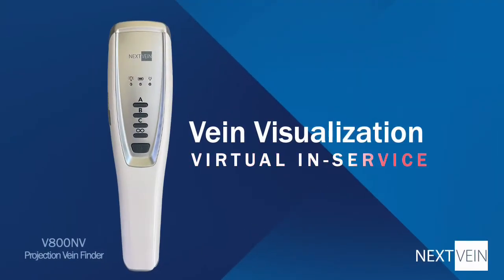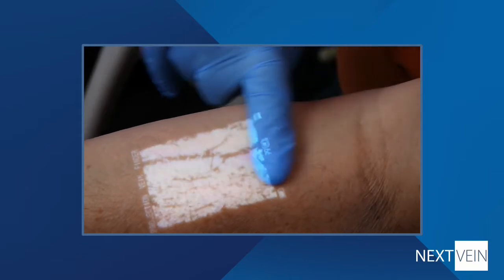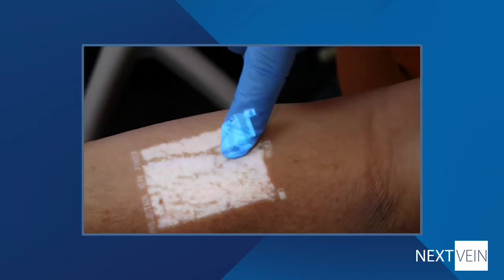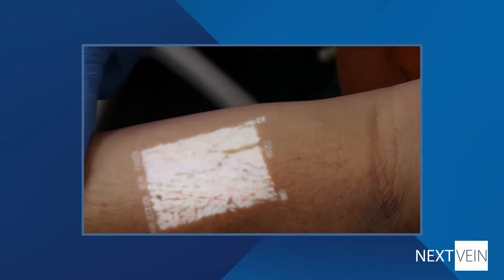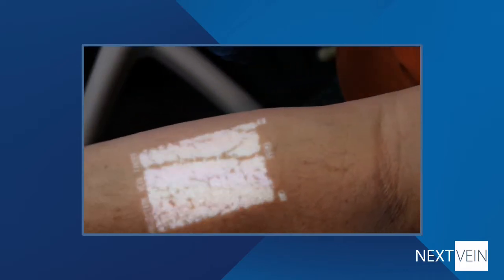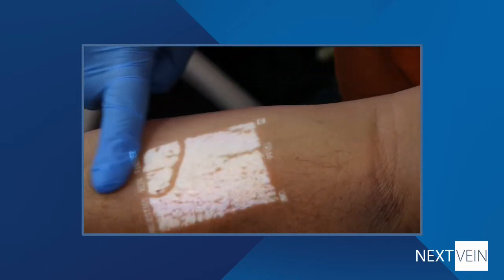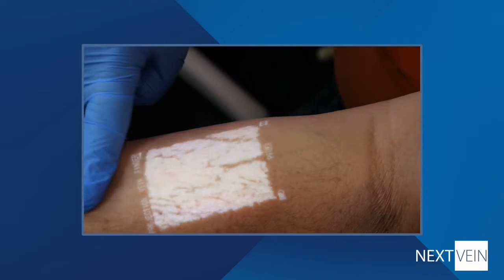Hello. This video will cover how you can be more successful by using vein visualization for IV starts and for blood draw. The next vein is a handheld augmented reality device that shows the location of peripheral veins that may be appropriate for cannulation. Studies have shown that vein visualization can help with first-stick success and in reducing patient pain, which can lead to improved patient satisfaction.